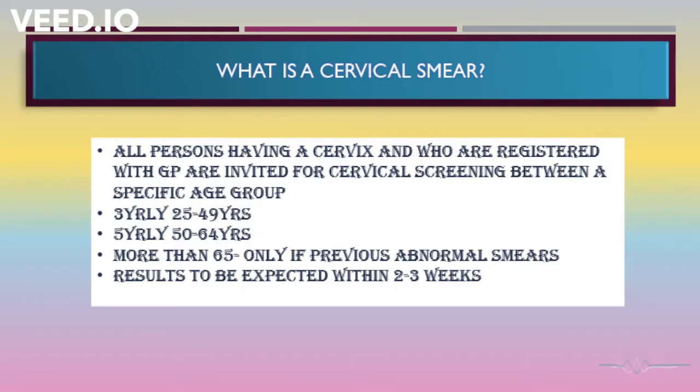So, when you have a patient in front of you, you might have a few questions that you need to answer. In these slides, I'll be going through some of the questions that they might ask and how you would like to answer them. It will be mainly in patient language whenever we are going to explain something. Since it is a procedure, in some OSCEs you are asked to perform the procedure, so we'll also have the steps on how to perform it. So, what is a cervical smear?